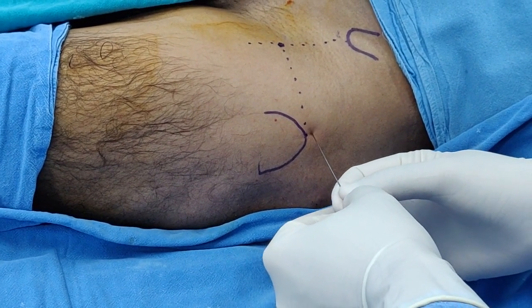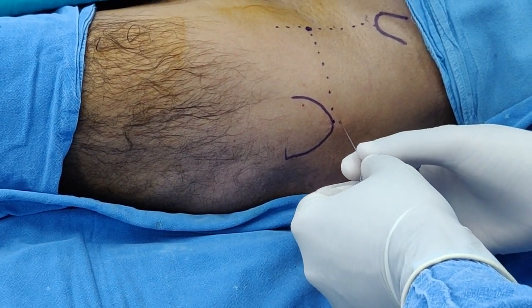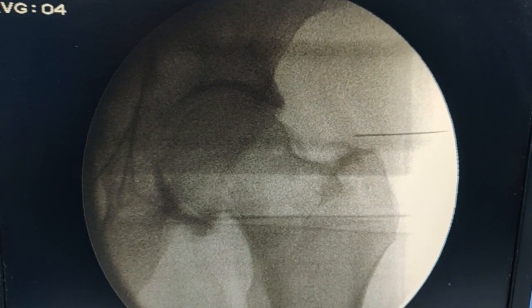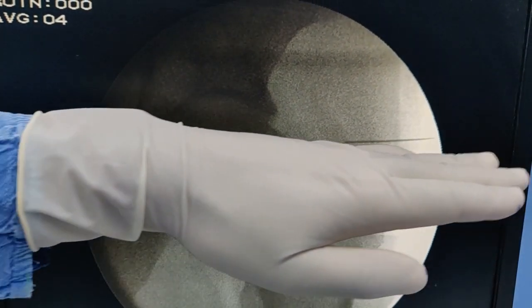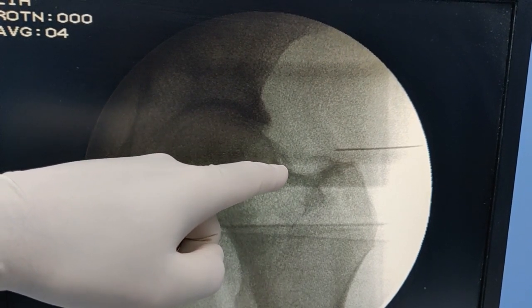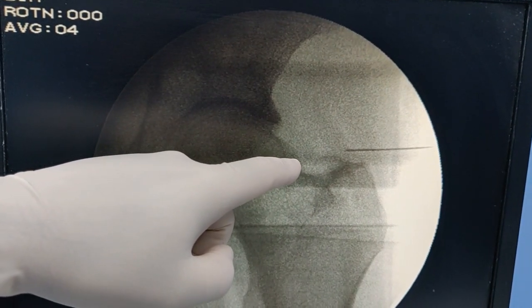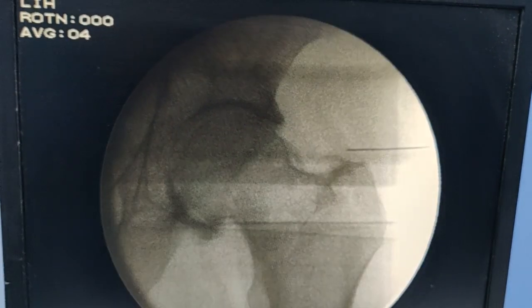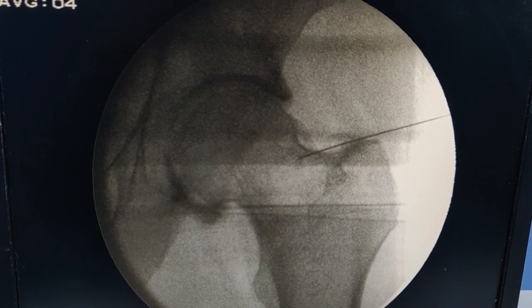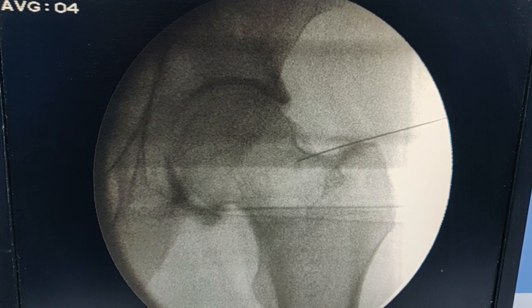I am going to use the same needle now, following the same track, and I will check under fluoroscopy whether I am at the right place. You can see that our needle is on top of the greater trochanter, and I am going to angle it slightly so that it hits the lateral aspect of the neck. You do not necessarily have to go into the hip joint itself — I am aiming for the lateral aspect just underneath the capsule. Now this is our position, and it looks okay, but I still have to check with Omnipaque whether I am inside the joint.